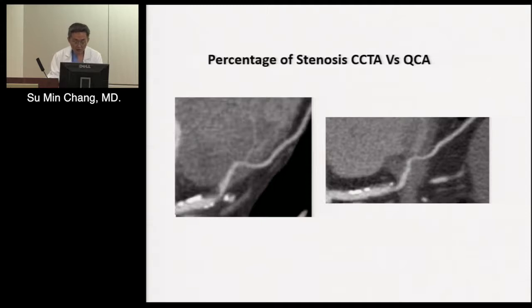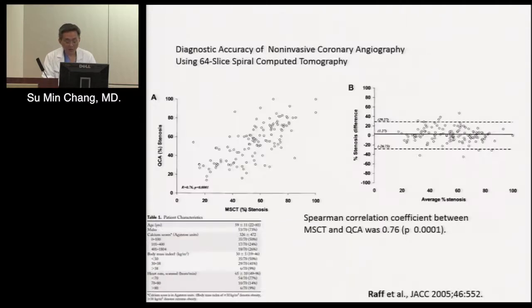Okay. So next, for the last couple of minutes, for those who went through our lab, I know everybody reports the coronary lesion a little bit differently. Some of us would measure the lumen diameter and the vessel diameter and tell you, okay, this is 30%, 40%, 50%, okay? But we need to know when we give the number, is it really accurate and representative of the true coronary lesion? So this study has been a while, almost over 10 years.